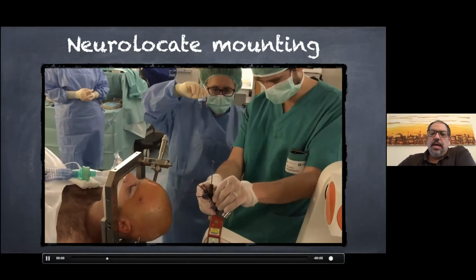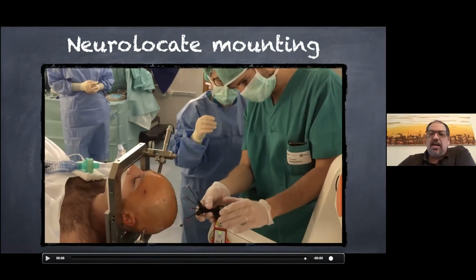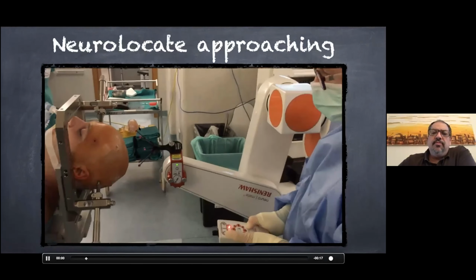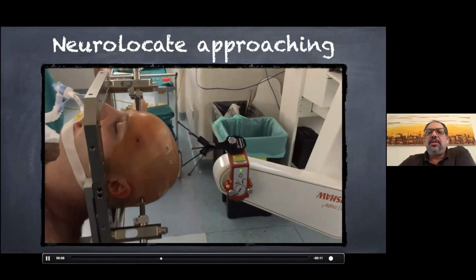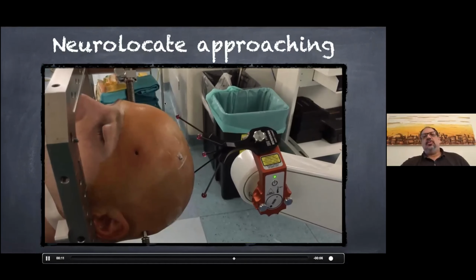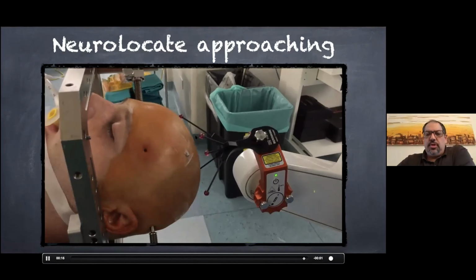So we use this tool that is called Neurolocate. It is attached to the robotic arm, and then it is approached very close to the head of the patient without touching the head of the patient. So it is a situation of frameless, touchless registration with the unique situation in which the fiducials are not fixed to the head of the patient, but they are fixed on the arm of the robot.